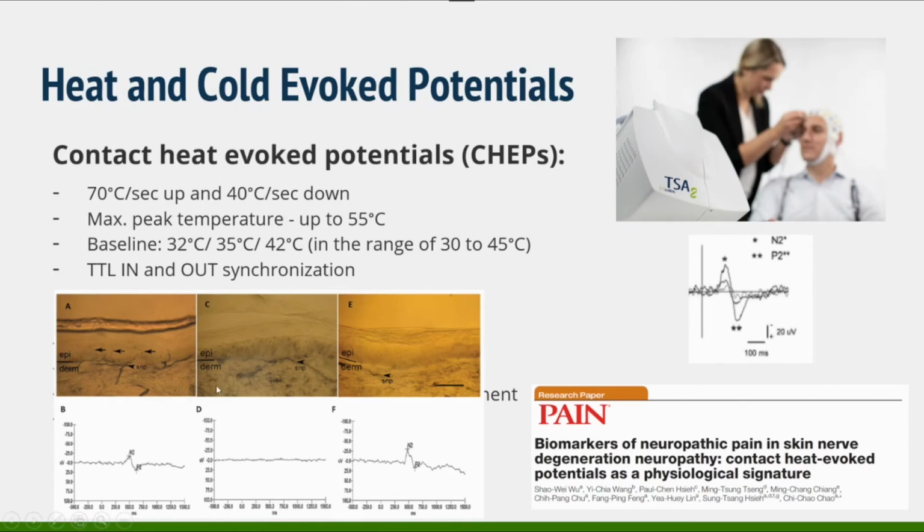That you can see in biopsy has abnormal biopsy and also absent evoked potential. So showing that decrease in the fibers in the skin results here in absent evoked potential and serves as a biomarker of neuropathy, of diabetic neuropathy in this case.